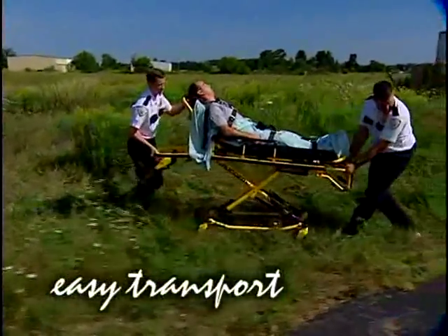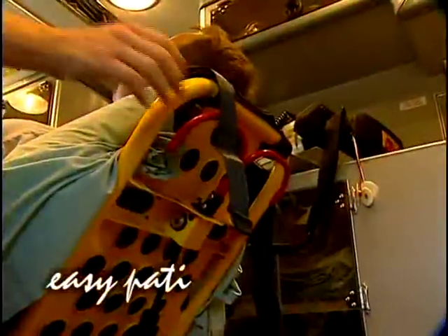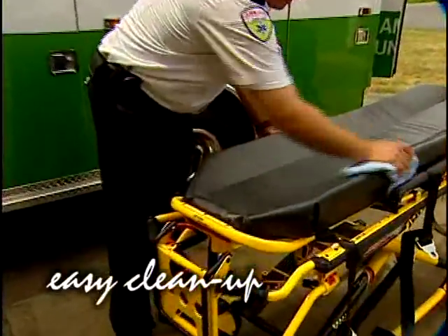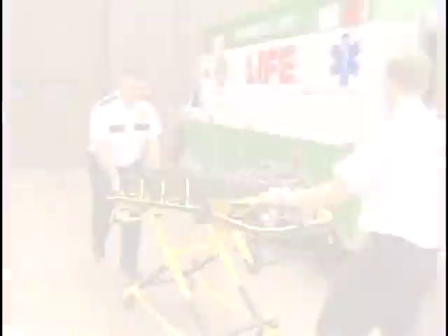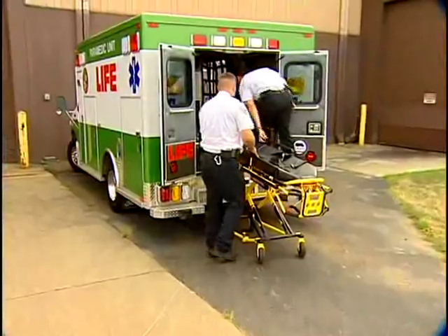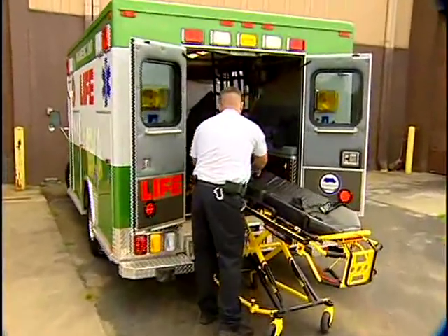Whether transporting, loading and unloading, providing patient care, or cleaning up, Stryker's MX Pro helps me do my job faster, easier, better. Who wouldn't want that?